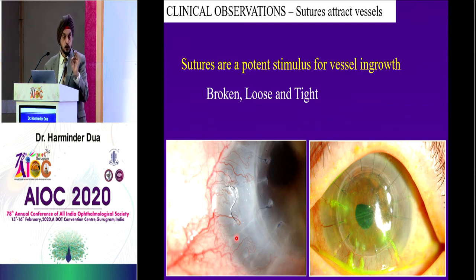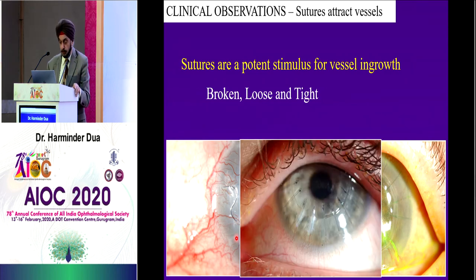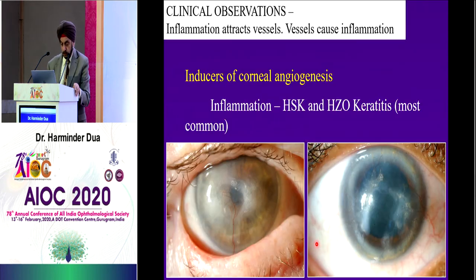No, it's doing no good, but it has potential for great harm. It'll attract mucus, attract cells, risk rejection, risk infection. So lots of harm, no good at all. So take out a loose suture when you can. So you can see over here again, a lot of mucus attracted to the loose stitch over here, and that's not of any use.